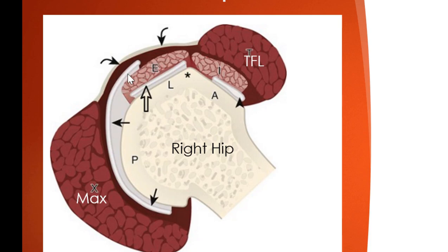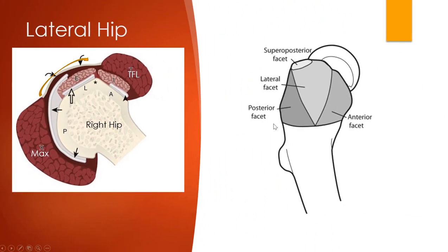So in this next patient, we're going to be looking for a click that's occurring out here at the greater trochanter. This is the posterior facet, which is largely exposed. If this image was to move higher, we would see the second band of the medius, which is the posterior-superior facet. Yes, there's also a subglute min bursa and a subglute med bursa, but less commonly we see fluid there. So we're going to look at this top layer moving in opposition to the rotator cuff underneath. The test we would use is what they call the Ober test.